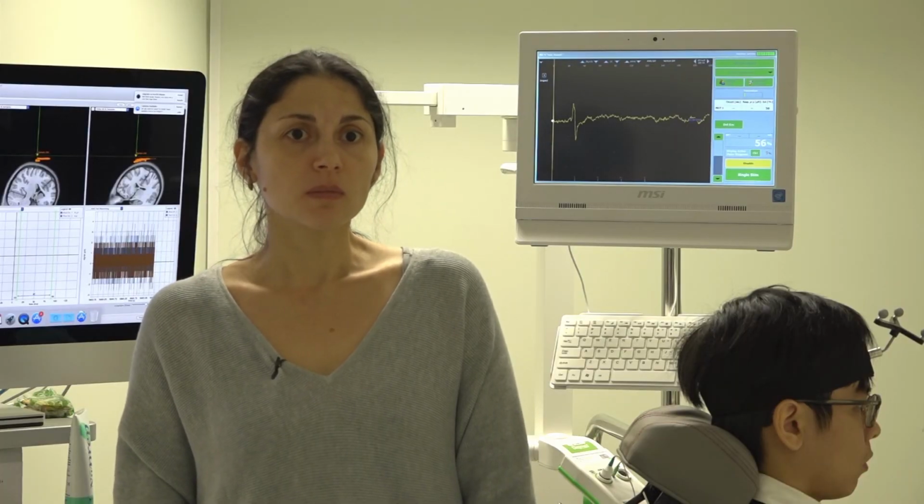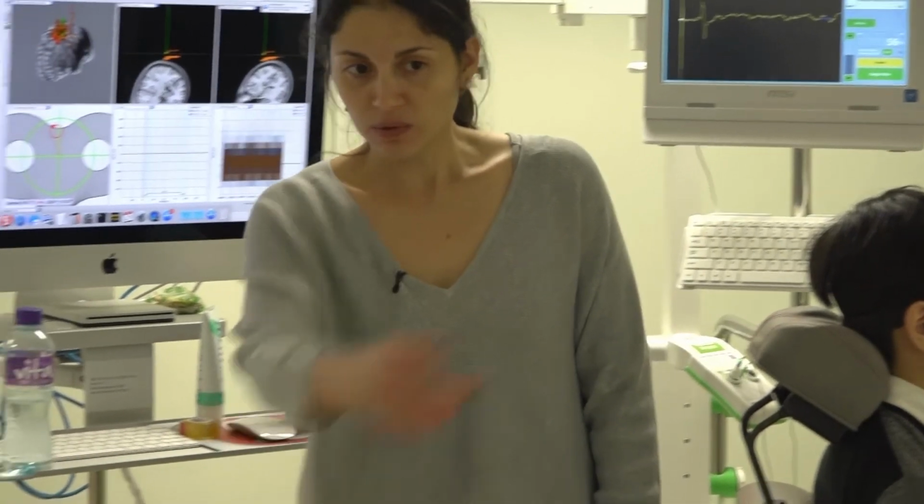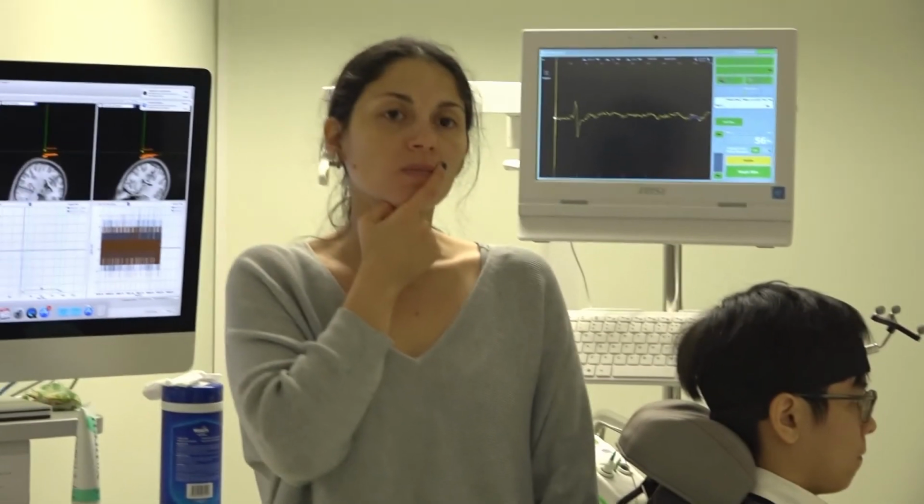Any question about it? Okay, so we can try. Thank you. So this is also a free download, right? This one that we use to calculate. Yeah.